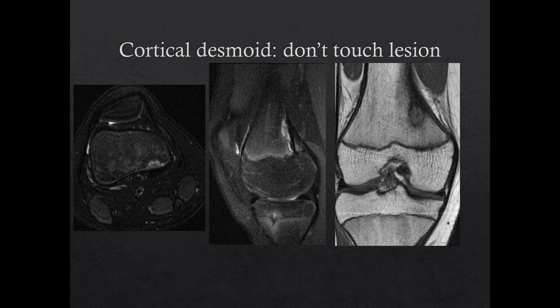Another variant seen at the knee is the equivalent of the cortical desmoid lesion seen by plain film, also called distal femoral cortical irregularity or avulsive cortical irregularity. It is at the site of attachment of the medial head of the gastrocnemius or adductor magnus tendon. It should be recognized based on its classic medial posterior location along the distal femoral metaphysis. It is subcortical and may have an ovoid shape on coronal images. Most of the time, this is an incidental finding.